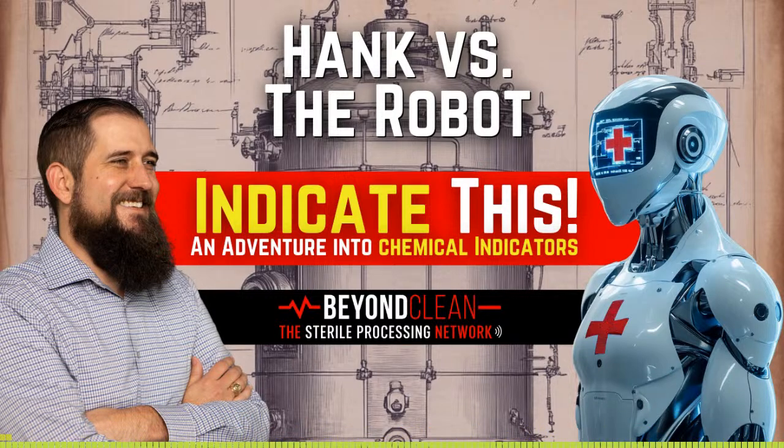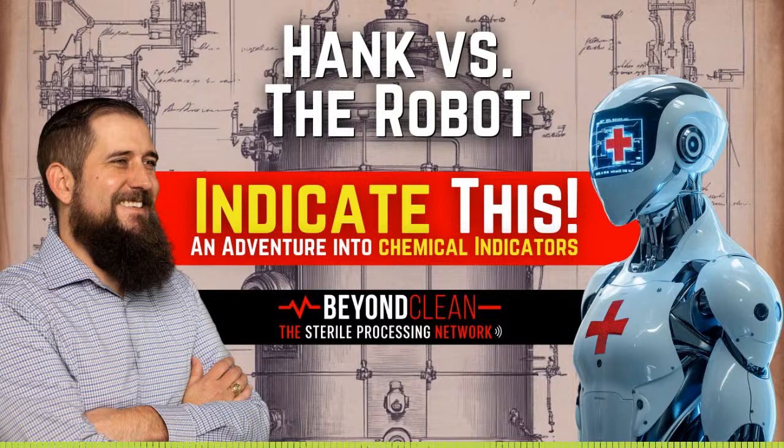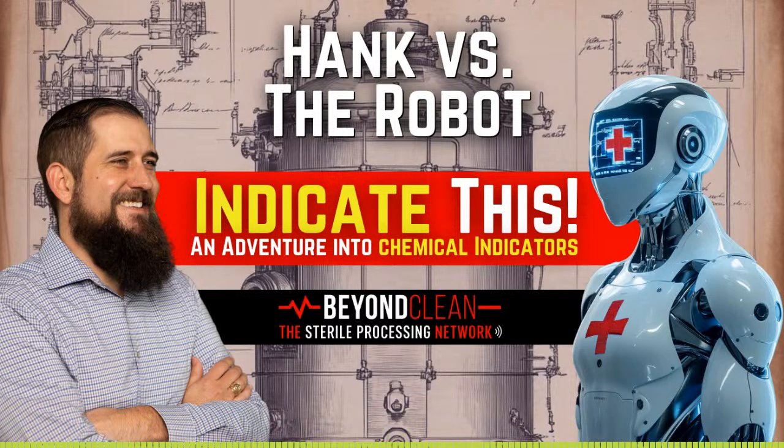Indicators are the frontline defense against sterilization failures caused by user error, e.g., improper loading, mechanical issues, or environmental factors like trapped air or poor steam penetration. Machines can't always account for every variable inside a load. Indicators serve as a check and balance for SPD techs. Without them, you're relying entirely on machine readouts and cycle reports, which don't provide immediate visual confirmation of success. Sterilizers are robust, but they're not infallible. Indicators provide redundancy in the system, giving a second layer of assurance that everything worked as planned.